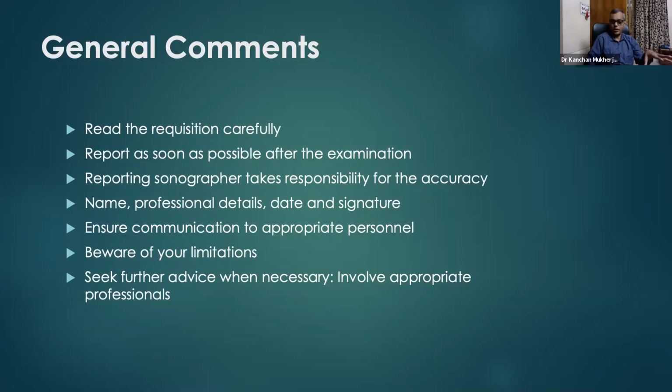Okay. Now, your job is not complete unless you have done a proper communication to the appropriate personnel when it is necessary. There are times when you need to pick your phone up and say, this is what I have got on the scan, and this is what I have written. The patient is going to call you soon. That's very important.